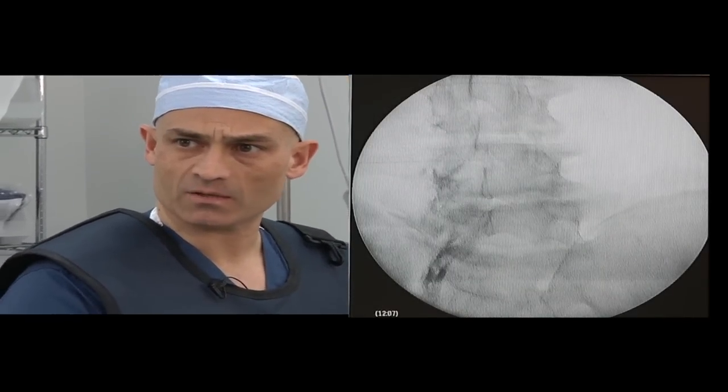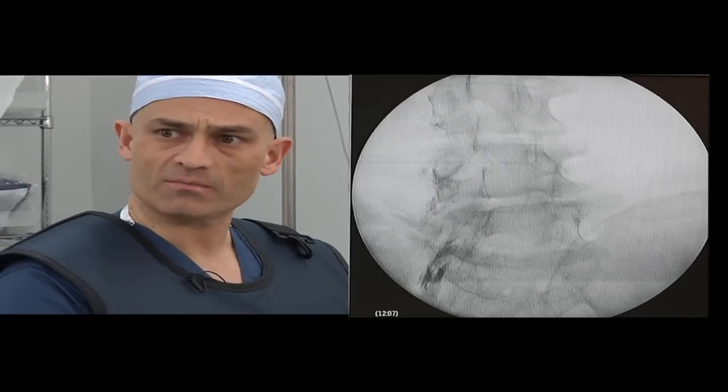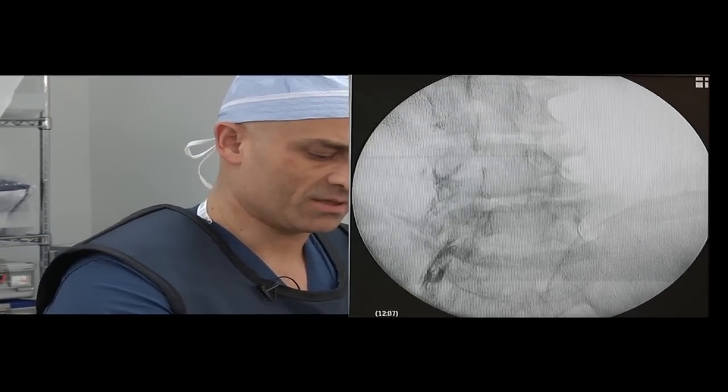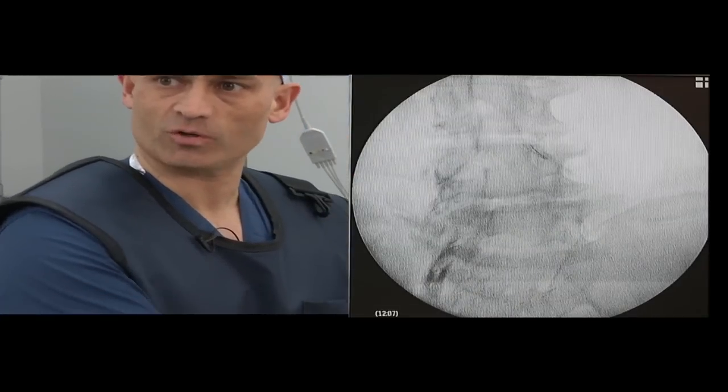Using the same technique with fluoroscopic guidance, the lumbar facet joints are visualized. The needle is advanced under fluoroscopic control.